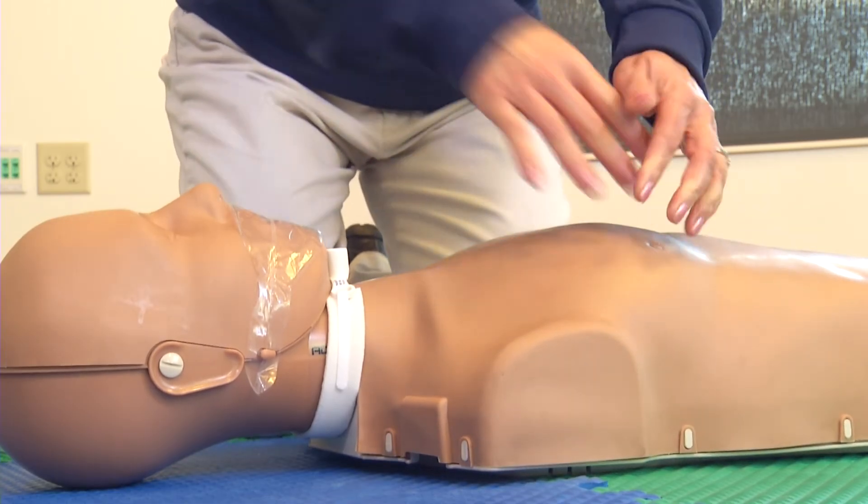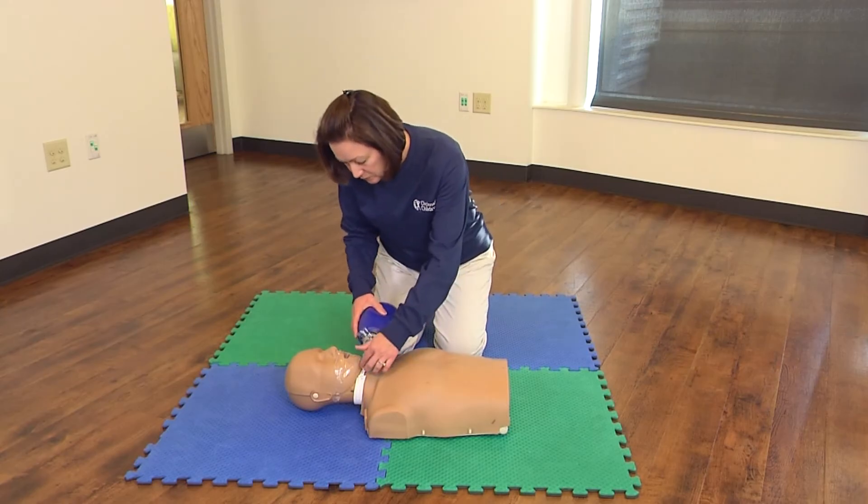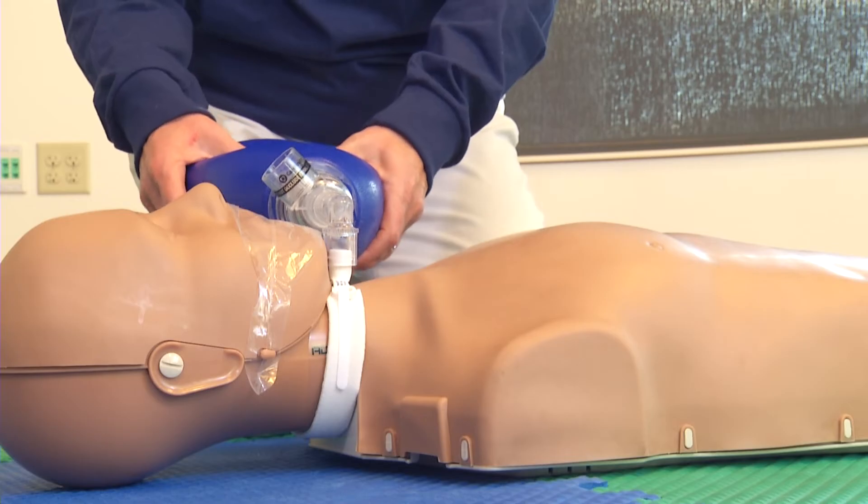After the compressions, give breaths. Give breaths using a resuscitation bag attached to the trach. Gently squeeze the bag and give 2 breaths, just enough to make the chest rise.